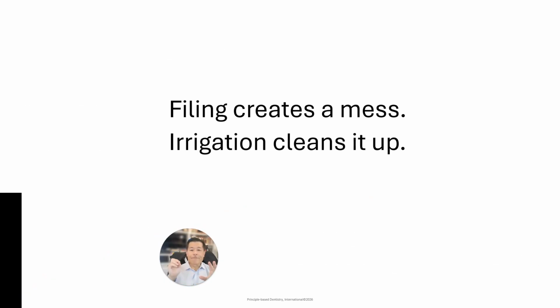So I want you to remember that filing creates a mess. It actually dirties up the canals. It's the irrigation that then cleans that out. And not only does it help us to lubricate and to suspend all that dental mud debris, and then when I rinse it out to remove it from that canal, but when we're using our sodium hypochlorite, we're actually disinfecting and dissolving the tissue that our files may not even touch.